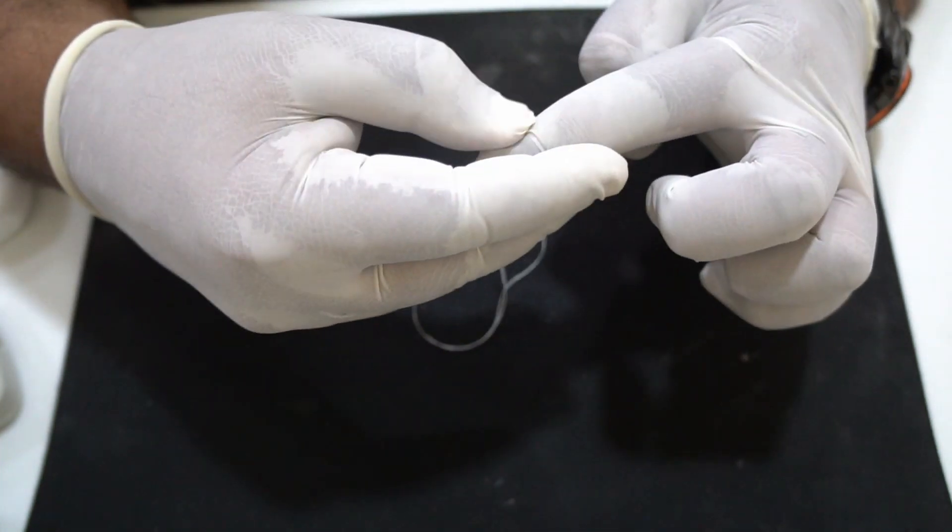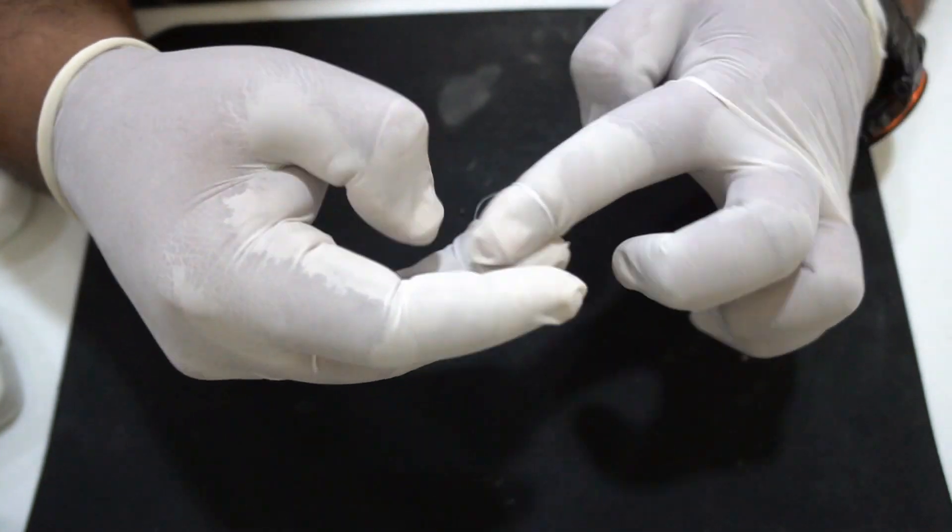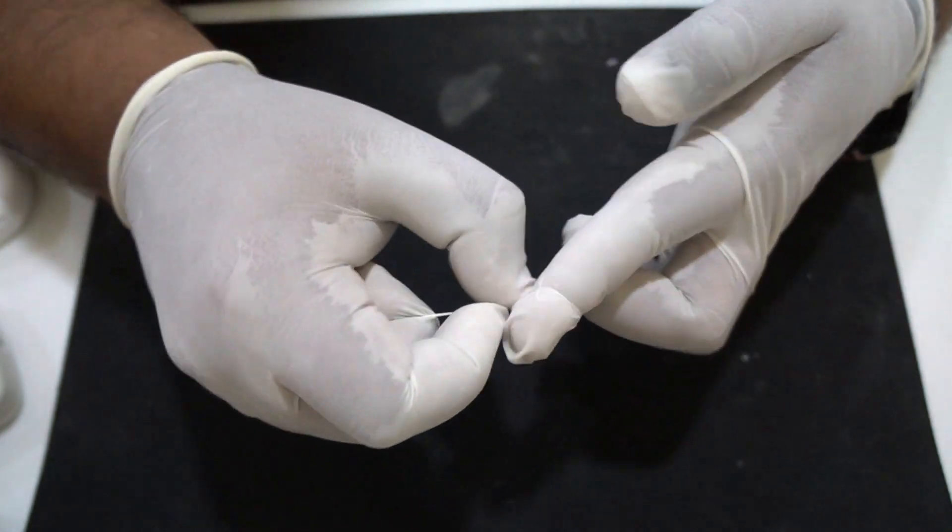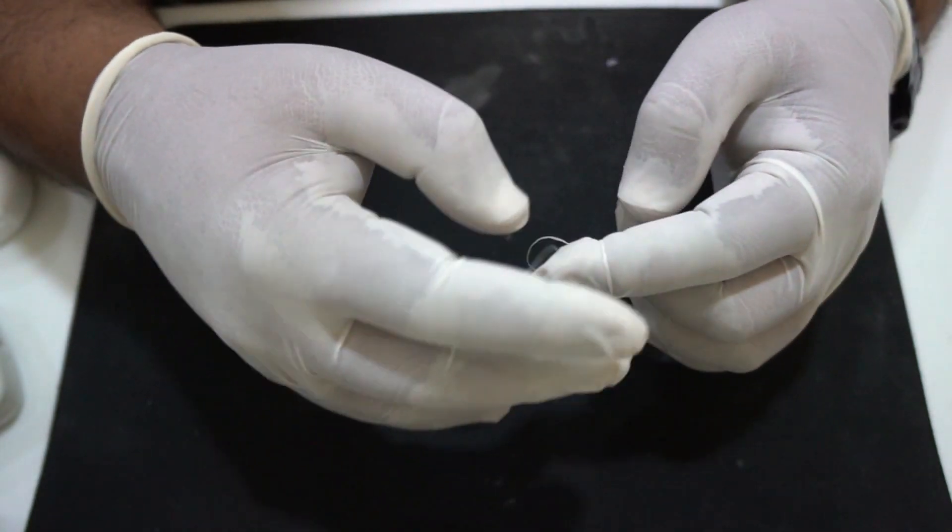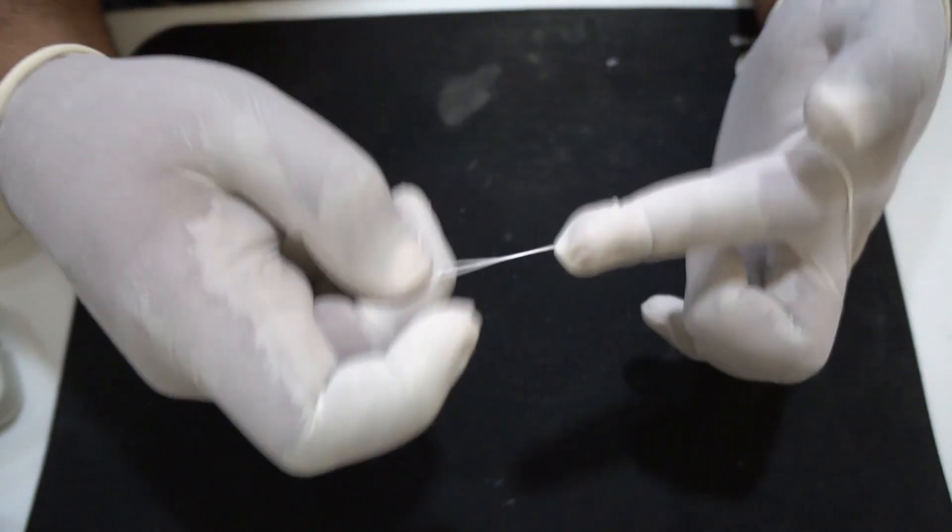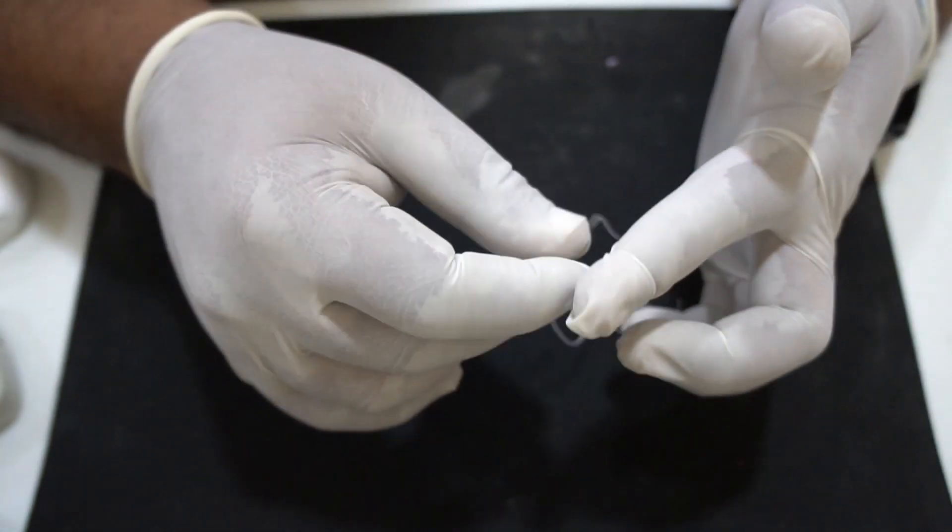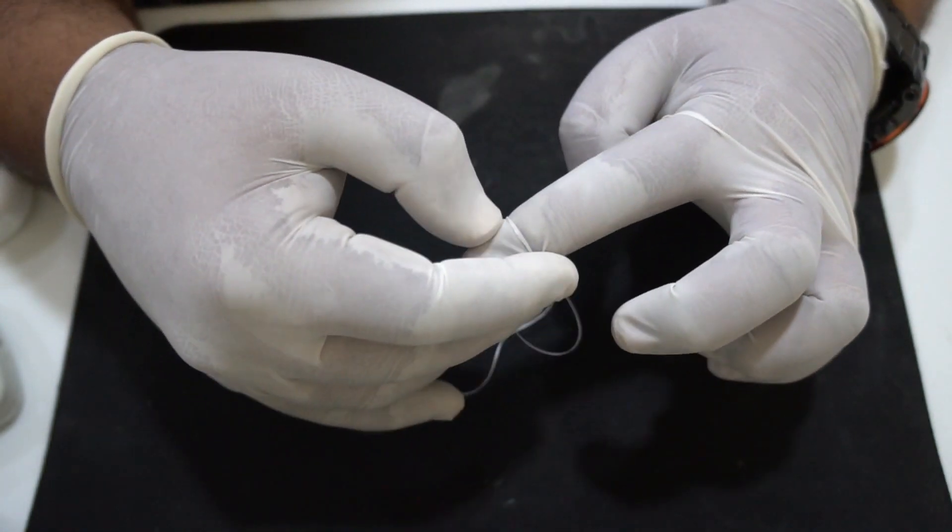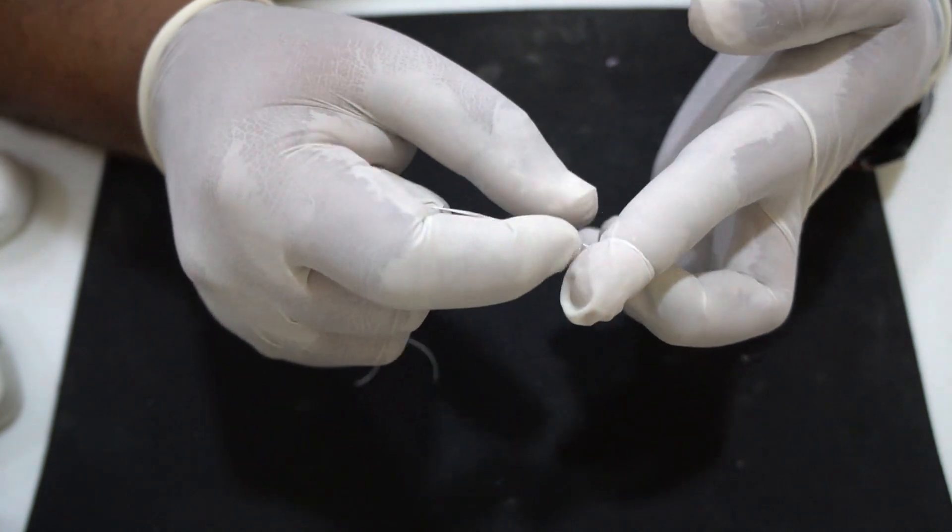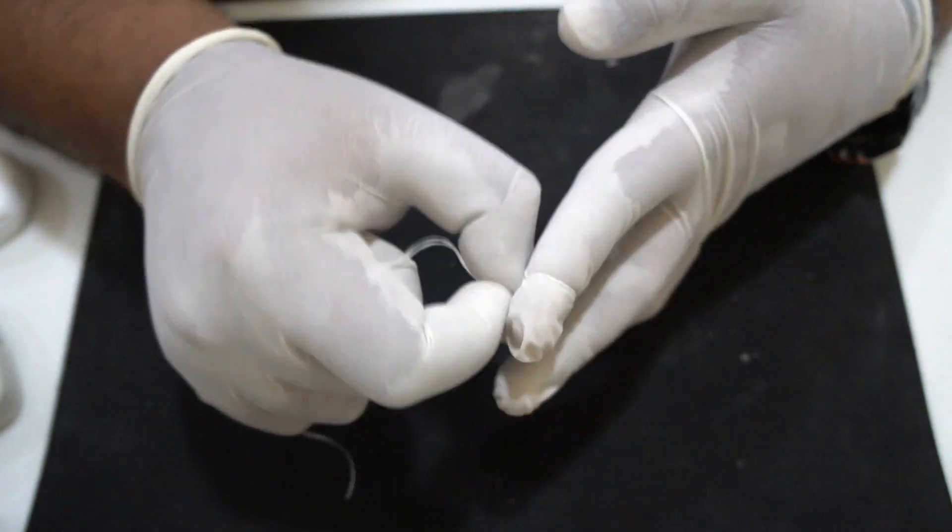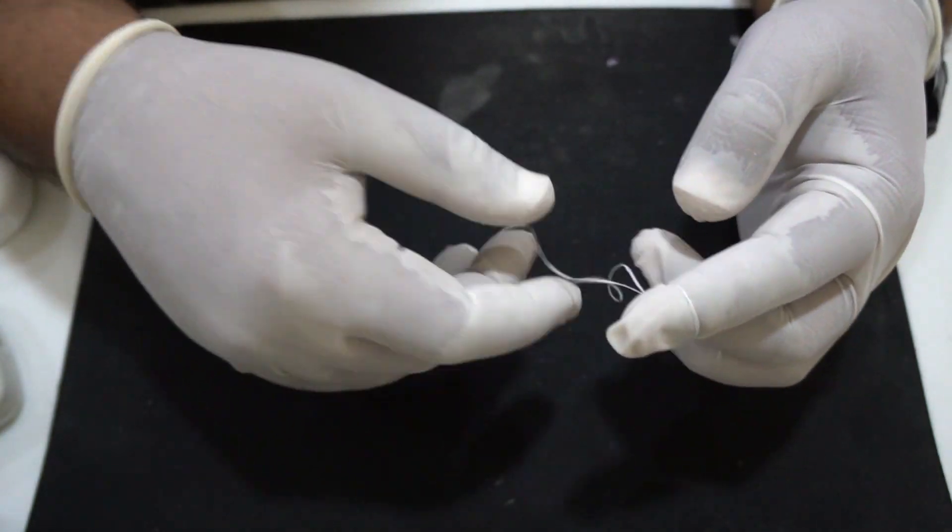So what I will do now is I will try to replay this in slow motion so that you can see it more clearly. You can see how tight this is. It's actually quite difficult to remove it. So I will just play it in slow motion so that you can see it and follow along.